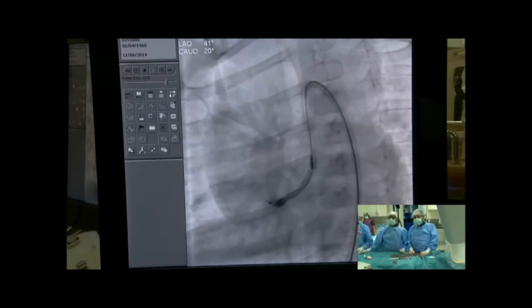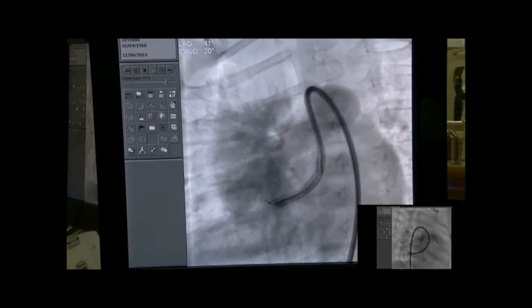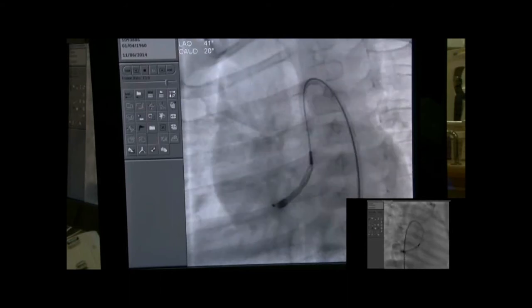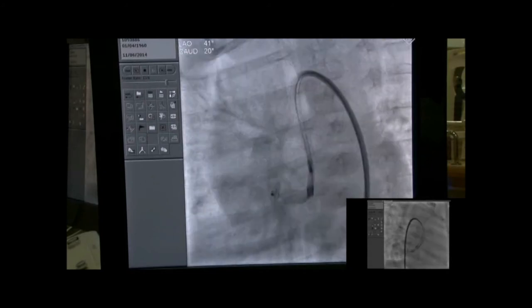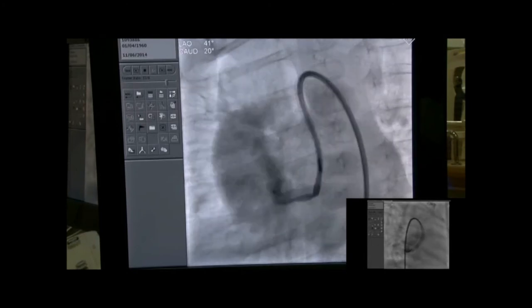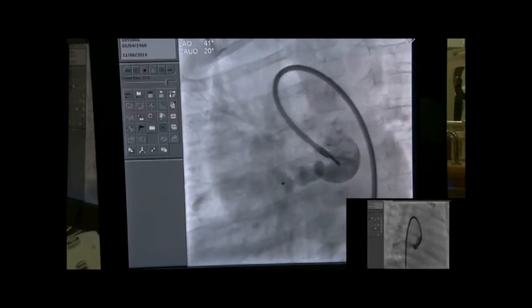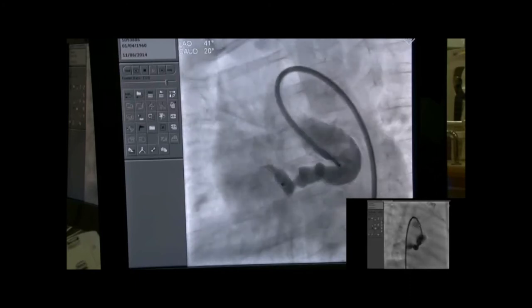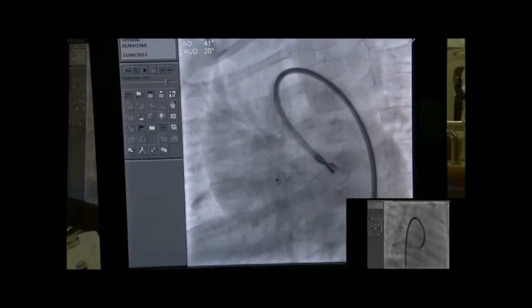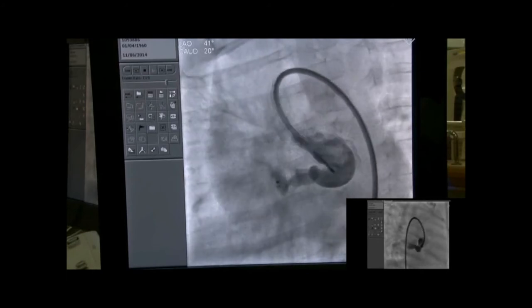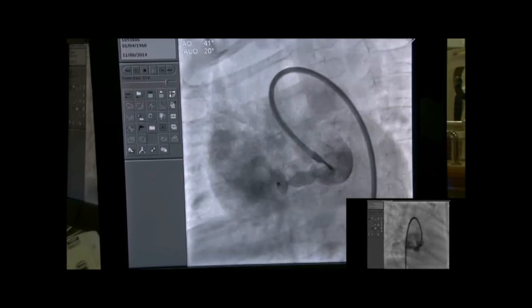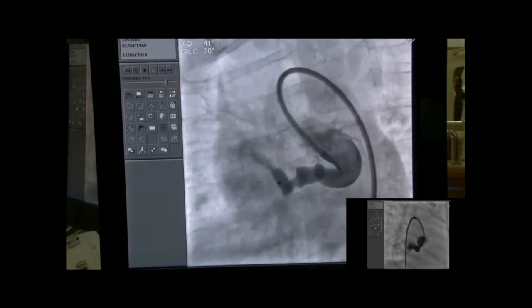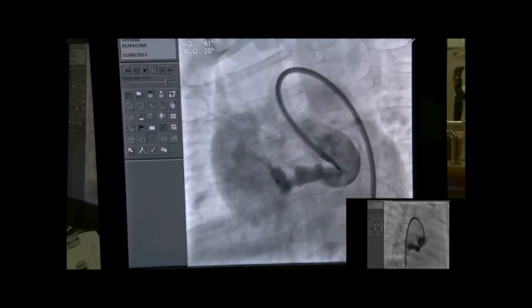Here is the 8 mm AVP2 with the distal disc open in the distal part of the fistula, and the middle segment and proximal disc all attached. Here you see the middle part of the AVP2 deployed. The proximal part is deployed, and at the moment the device is under tension — the middle part is reasonably at a constriction and hopefully that will occlude the fistula. The proximal disc hasn't fully formed yet.